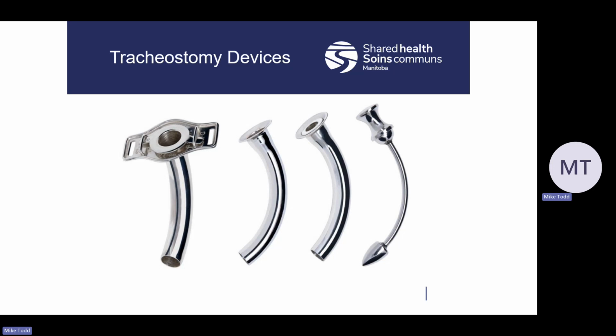So one of the first devices we're going to look at here is your tracheostomy devices. The first one here is a stainless steel. These are original ones, kind of old school. They're not commonly used anymore, but patients with the devices previously sometimes opt to continue to use these instead of using a newer device. Sometimes these devices are also used with patients who have difficulty with chronic infections, or they just have allergies to the plastic or silicone devices, so they have contact irritation of the throat, but not really something we're going to commonly deal with.